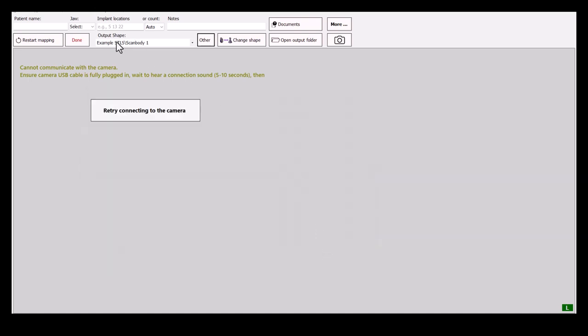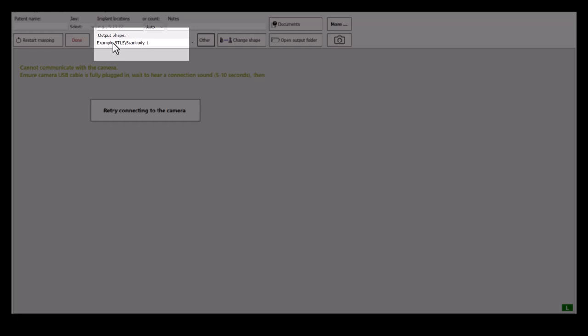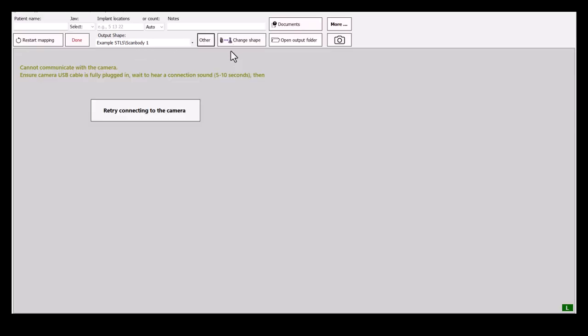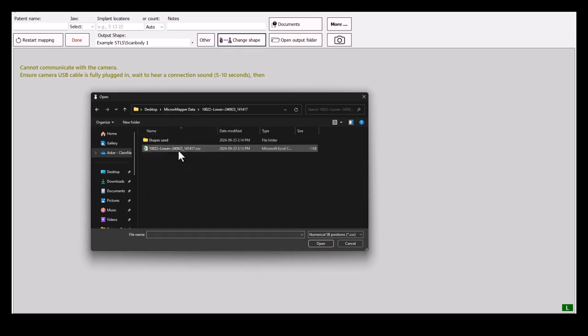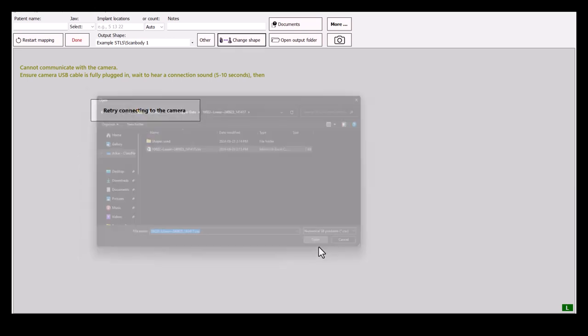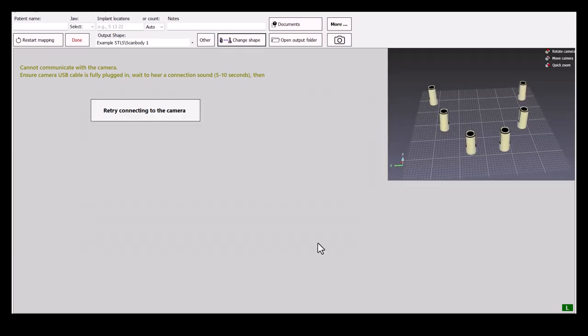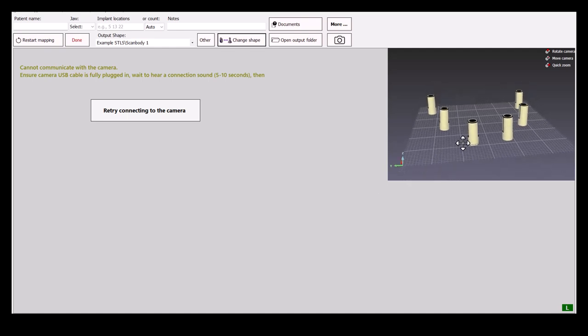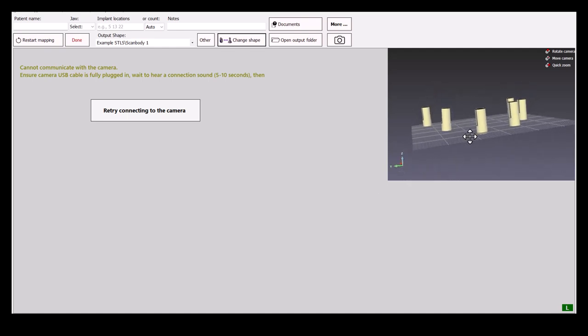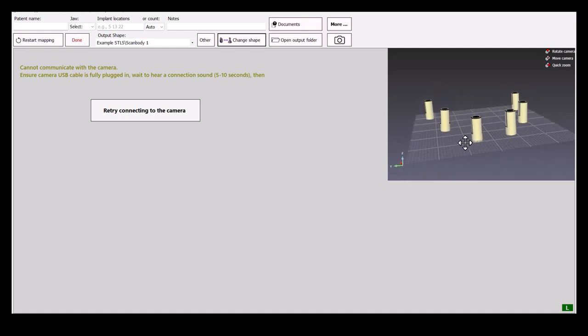As you can see, the output shape has now changed. Let's check the shape by importing existing scan. As you can see here on the right, the shape appears to be imported correctly.